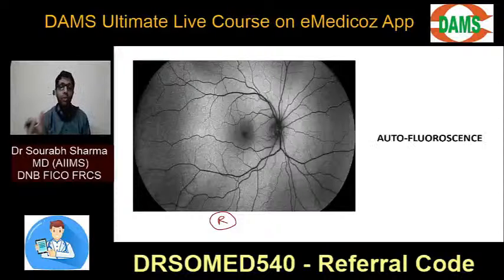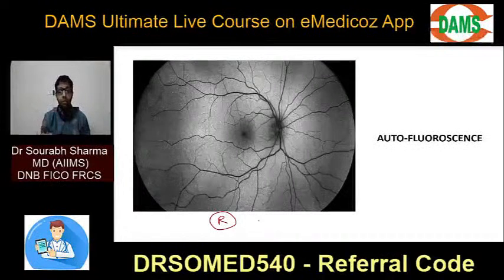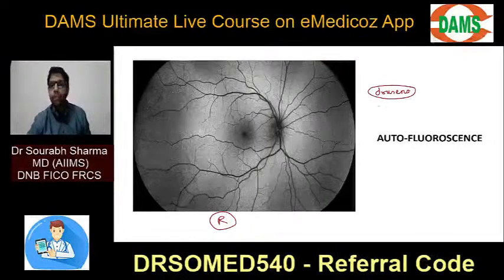This is autofluorescence. Do you remember what the property of fluorescence was? Low wavelength comes inside, high wavelength goes outside. There are some deposits in the retina. One I have told you today, drusen, and one more is lipofuscin.